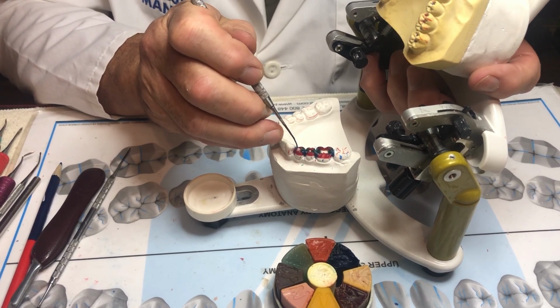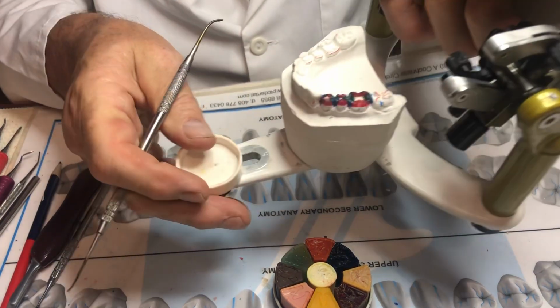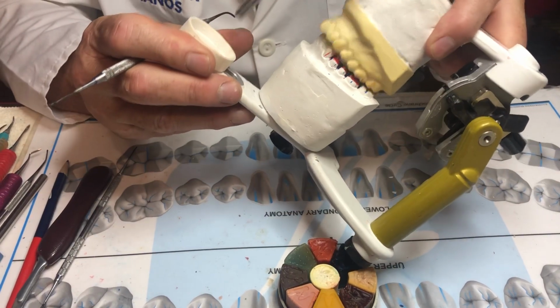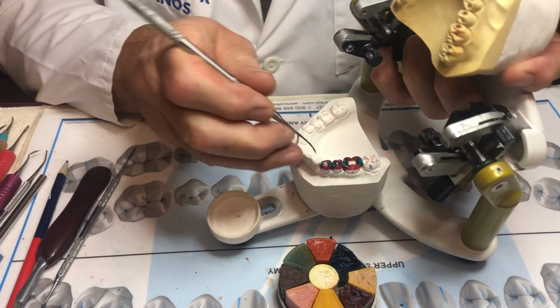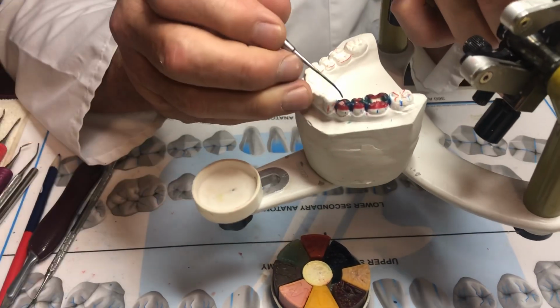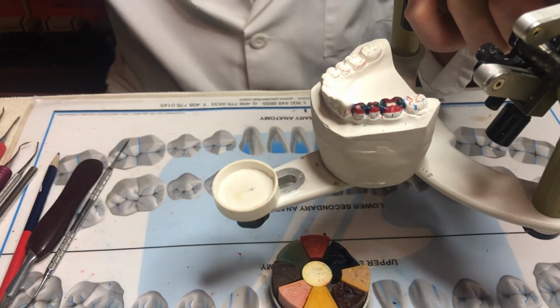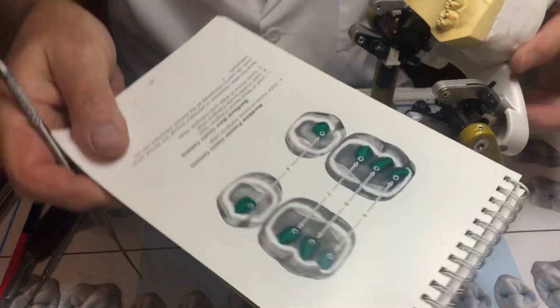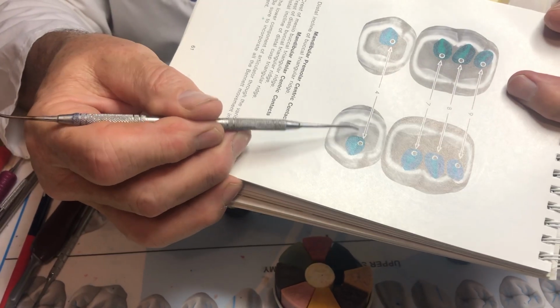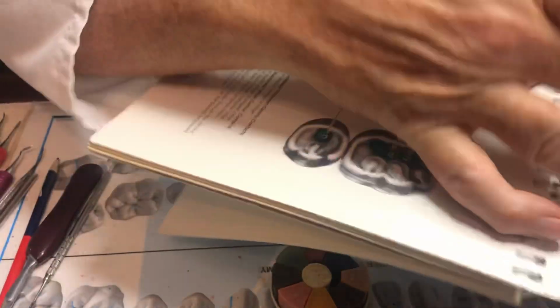So I'm building up the triangular ridge. I think you can see it. So let's close it and see if I have my contact. And there's my first contact. If you look carefully, you can see that I'm touching, and if you look at the textbook, I've just established that contact. Now I can flick over to the other page.